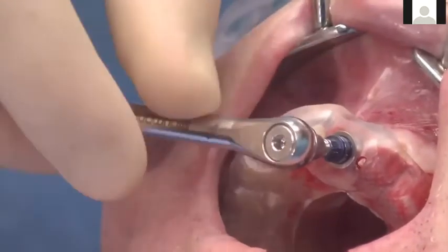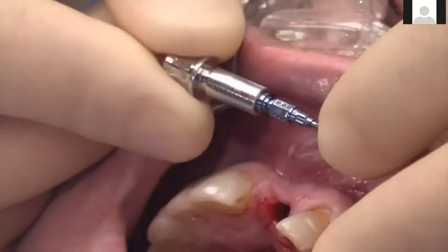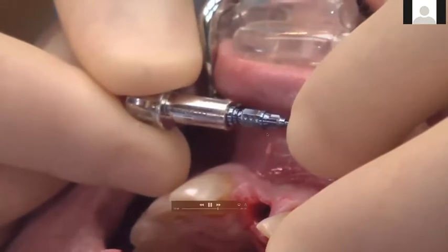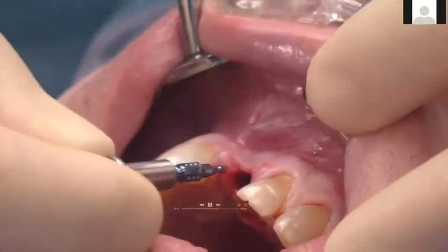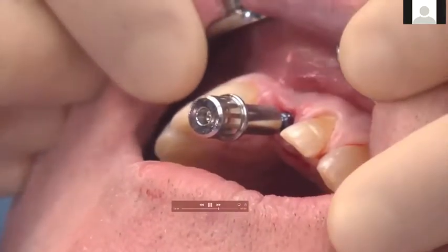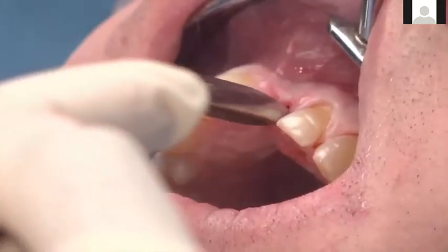And once we have reached that, then we know that we have put the implant, but it's not 100% to depth. So now we switch to this non-guided mount again, which is thinner, and now we can go in deeper. The nice thing is that these have got markings on them too, 1, 2, 3. So you can see how deep you place your implant, so you can judge the implant placement depths that way as well.